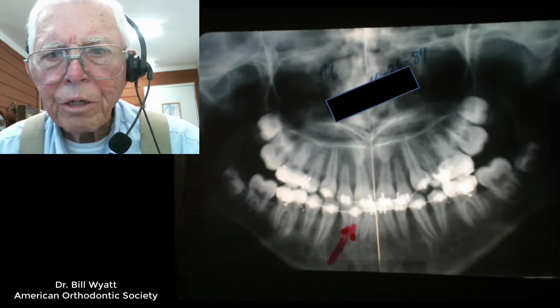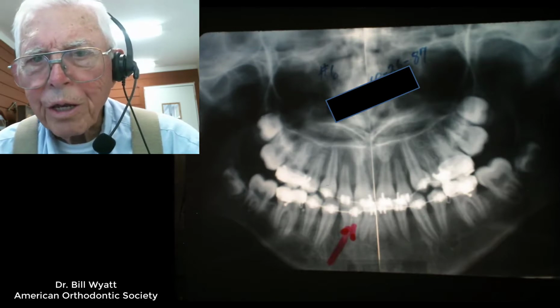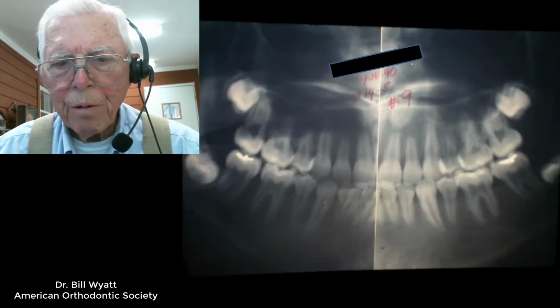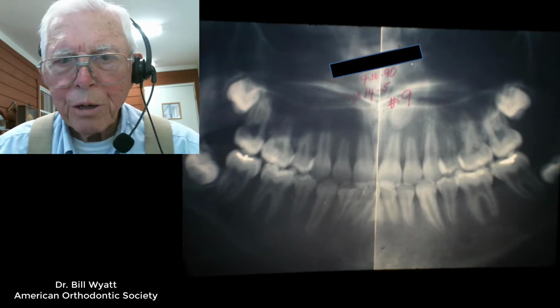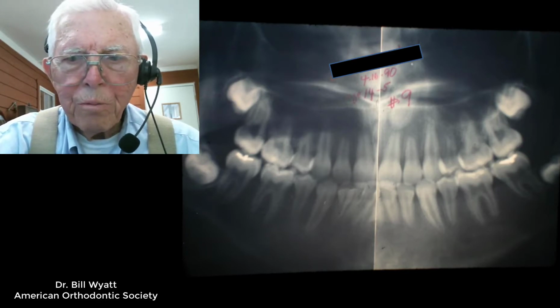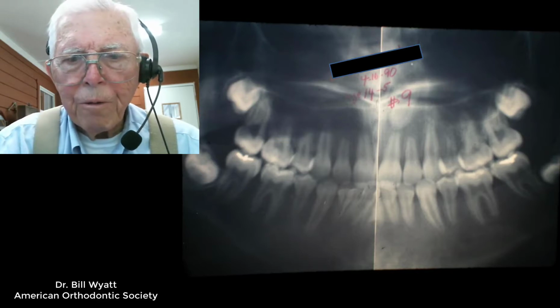Well, here it is. I don't know which x-ray that is, but anyway, that's close to the end. And we took that fused tooth and lined it up like just one big tooth. He's age 12 and 11 months, nearly 13 at this point. Everything's in. You can see the little fingers we've got for the tongue thrust problem. And that breaks the tongue thrust, and now we've got him in a class 1 relationship, and this is video number 9, and I don't have one where his wisdom teeth are coming in, but everything is off and cleared up.